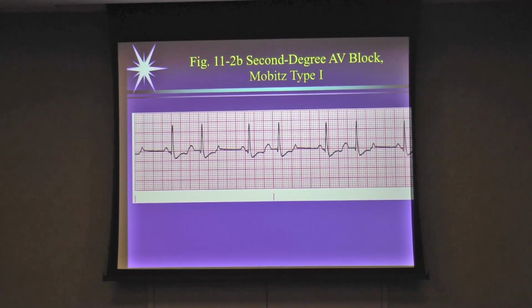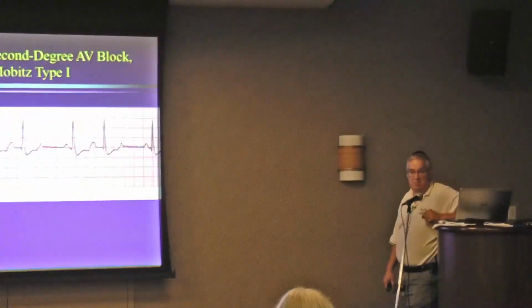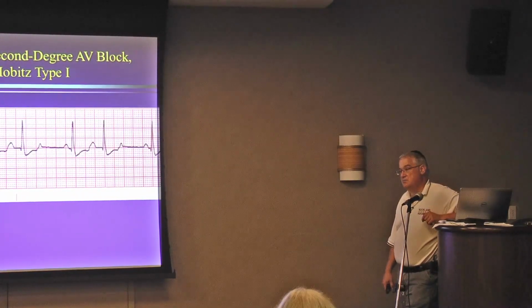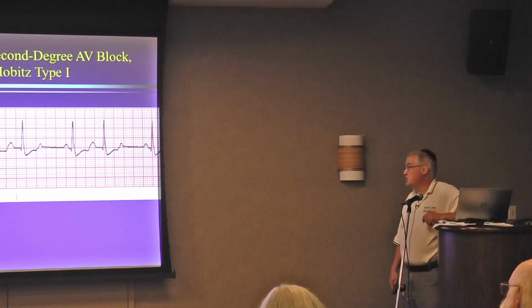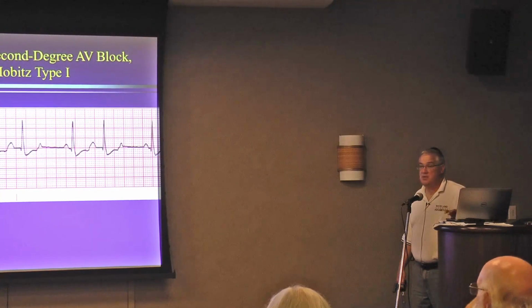I've had patients call for chest pain and had this. I've had patients call for reasons other than their heart, and you put them on the monitor and you see this, and you ask them, did the doctor tell you that you had an abnormal heart rhythm? And they say no. So they may have been in it for years for all they know. So you're always treating the patient, not the rhythm. It really depends on how they're tolerating it and what their complaint is.